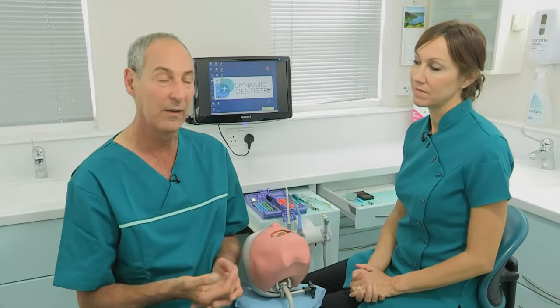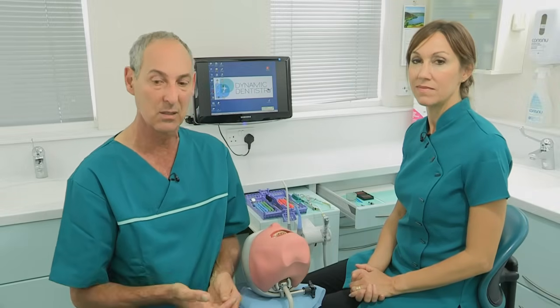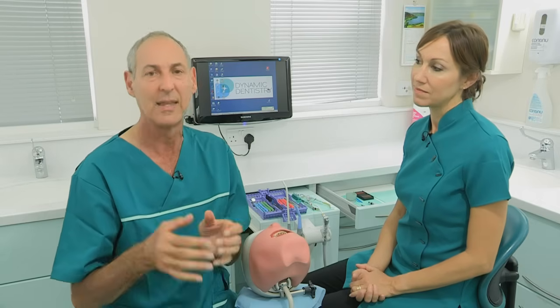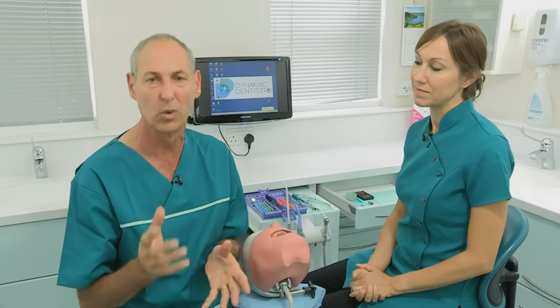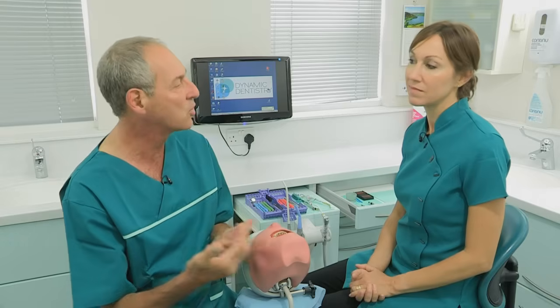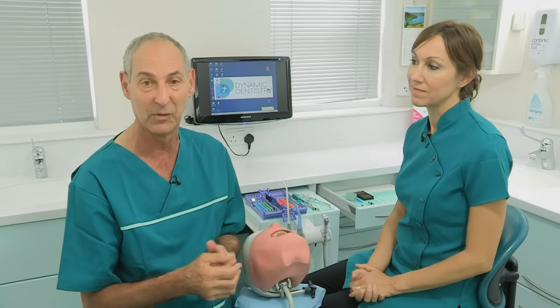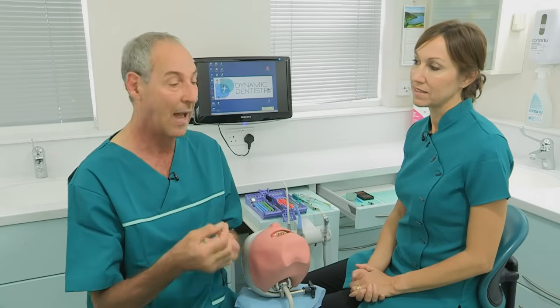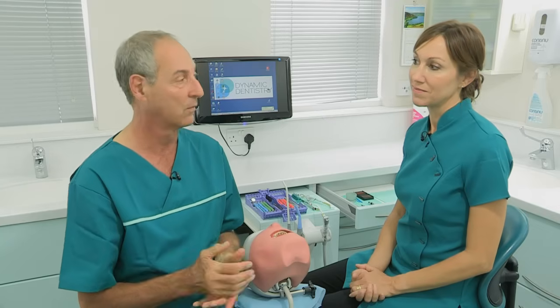So I hope that we've established that you can do a very safe instrument exchange between dentist and nurse. I don't need anything on this side. I know dentists are control freaks, and they like to pick up their own instruments, and they're not sure what they want at any one time. But with a little bit of communication, you can learn between you that Sally will almost know ahead of me, because she's been working with me for so long, what instrument I want. And I just sit there, look at the tooth, and that instrument's handed to me. What about your side, Sal?